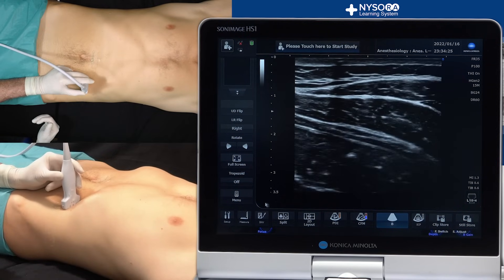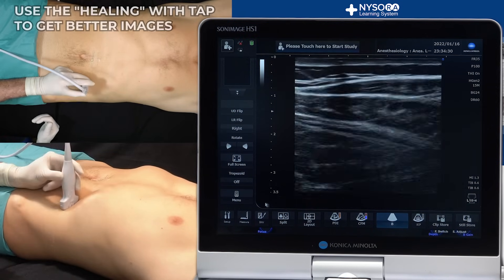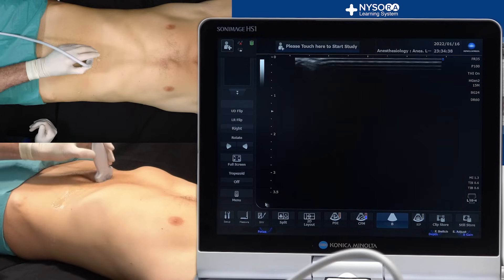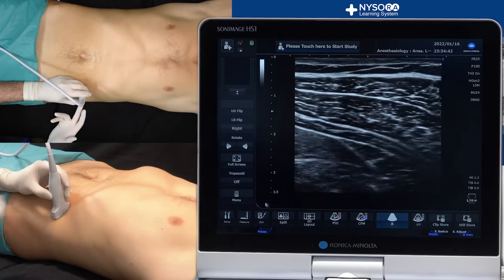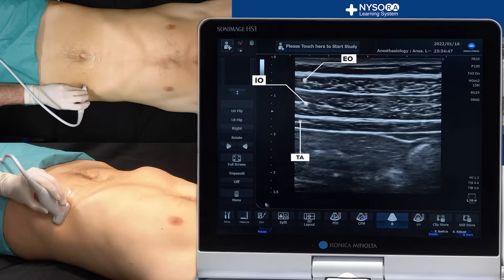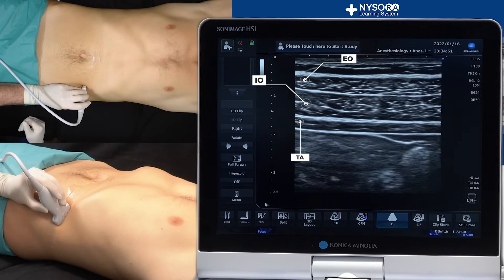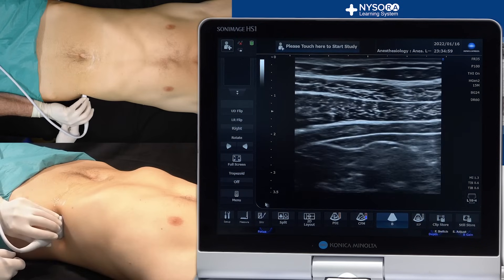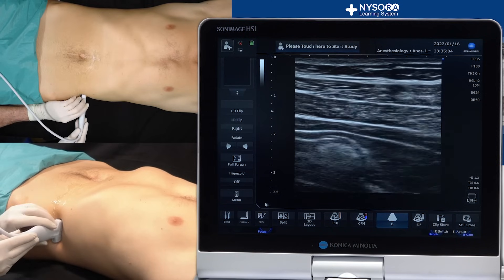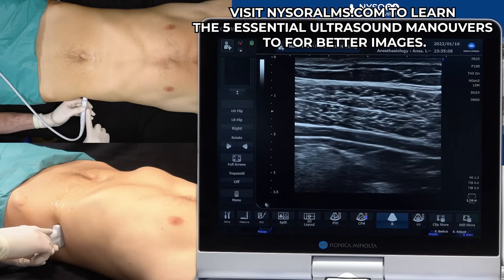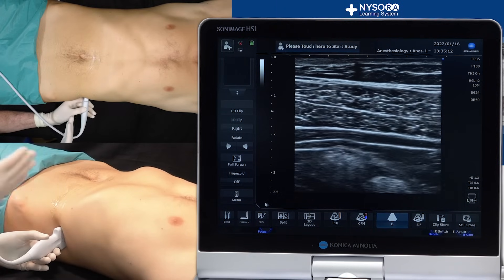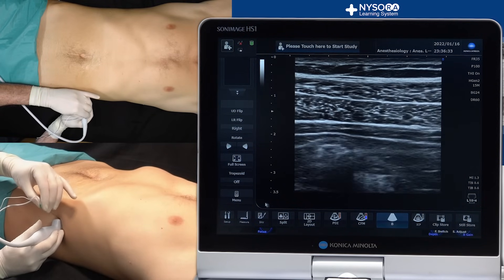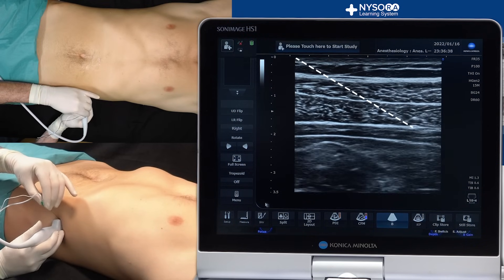When you do the TAP block, use heeling. Heeling of the transducer can really help you align those muscles nicely horizontally, like you see in textbooks. If as you go more lateral you do not heel, you're going to lose that nice image and the muscles will appear slanted. You really want to use the heeling maneuver to align the muscles of the abdominal wall horizontally. Continue going laterally and use the heeling maneuver — you can see the difference without and with heeling. Once in the mid-axillary line, introduce a needle in an in-plane fashion to reach the layer between the fascia of the internal oblique and transversus abdominus muscle.